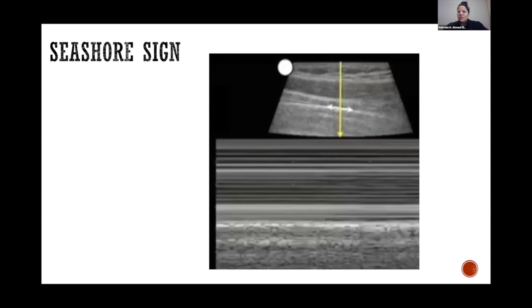I'm not going to review necessarily all the things about M-mode. M-mode is a mode on the ultrasound that allows you to study the motion of a structure at a given point across a line that you create. So what you see here is when you tap M-mode on an ultrasound machine, and every machine does this a little differently, you'll see a line that drops down on your screen. You can move that line based on which machine it is.